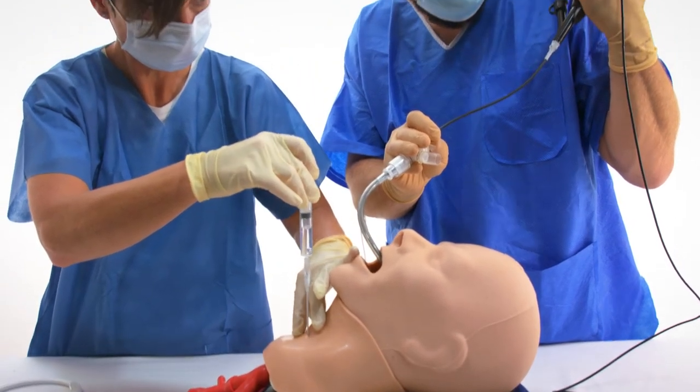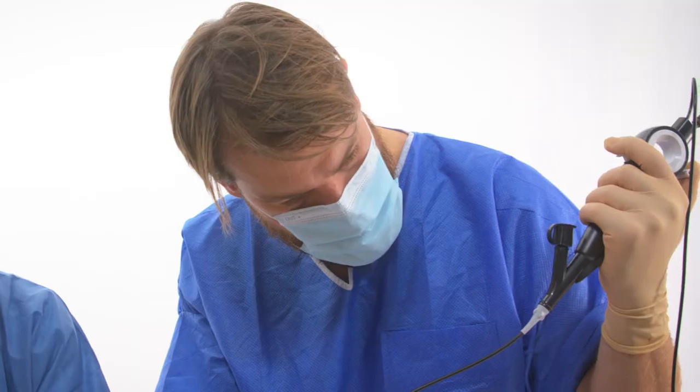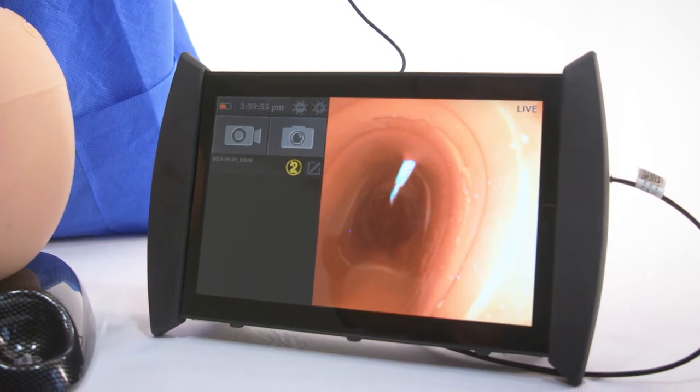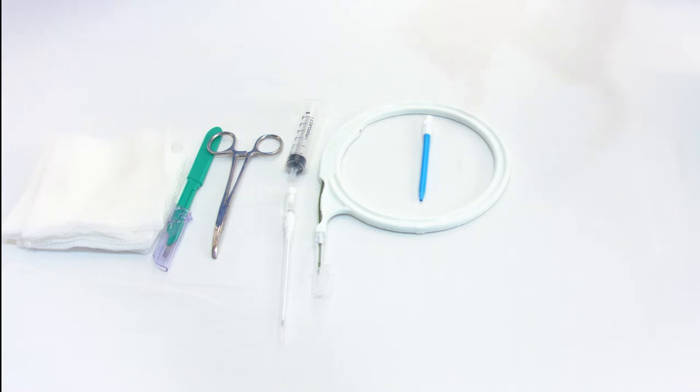Bronchoscopic guidance is strongly recommended during this procedure to reduce the likelihood of paratracheal insertion and to determine the intratracheal position of the needle, wire guide, dilators, and tracheostomy tube.